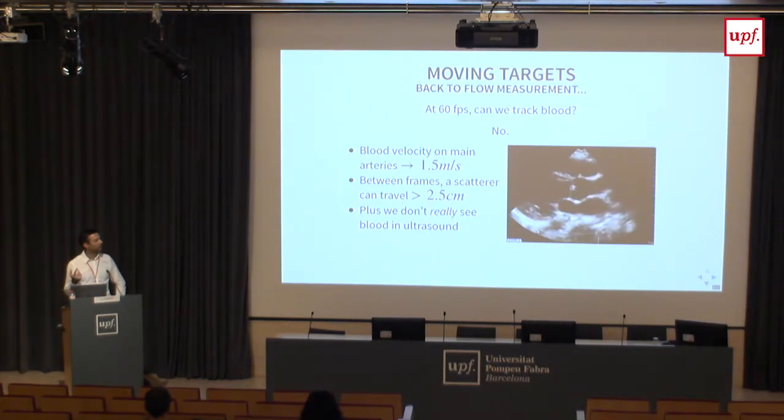Plus, there is the fact that blood flow is a 3D phenomenon. So if you are doing 2D ultrasound and you wait this long, your particle for sure has gone out of plane. And actually, the other interesting thing is that we don't see blood in ultrasound.